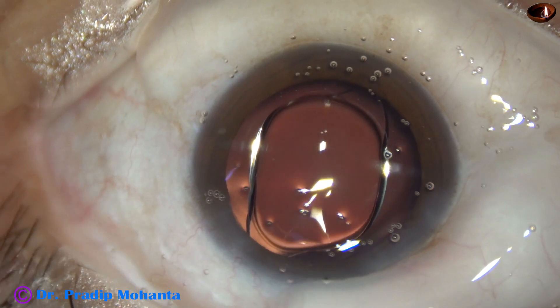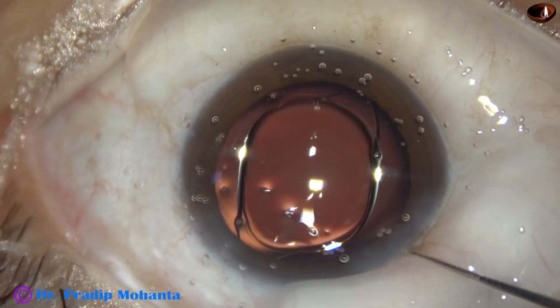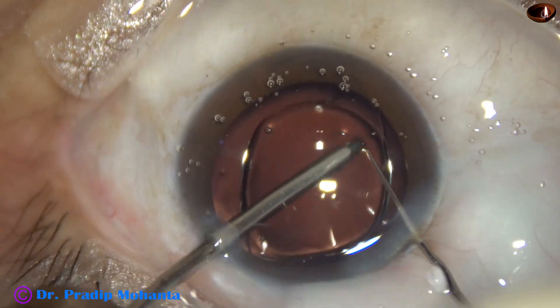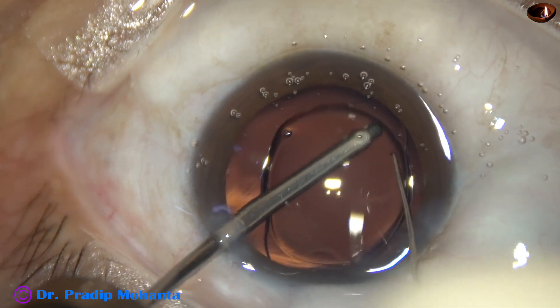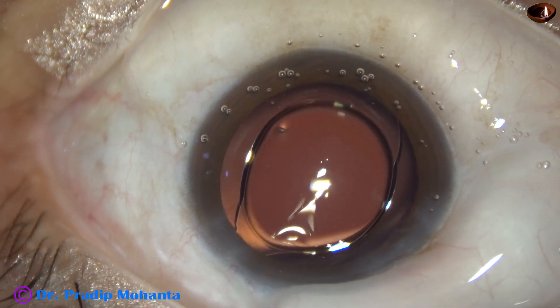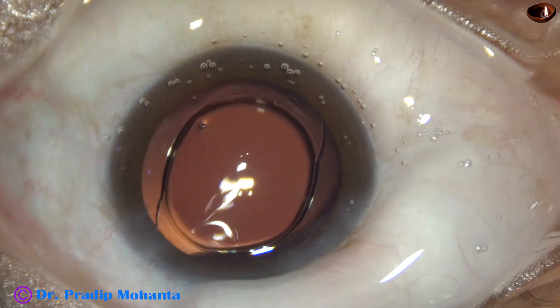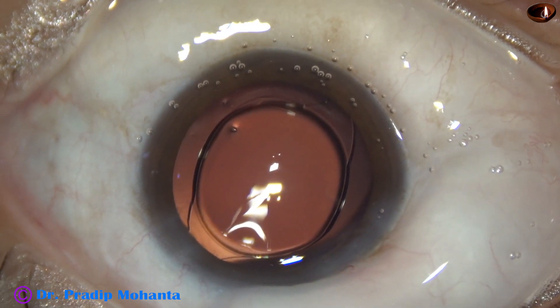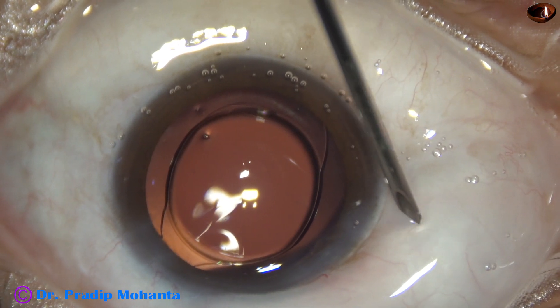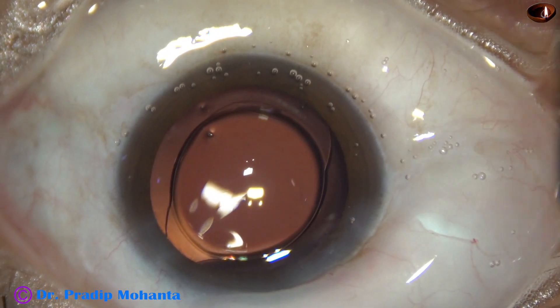To check whether the lens has gone into the capsular bag, you can check the rhexis margin adjusting to the haptics. If you can hook the rhexis over the haptics, then it is confirmed to be in the bag.